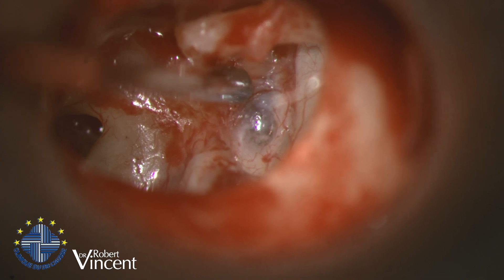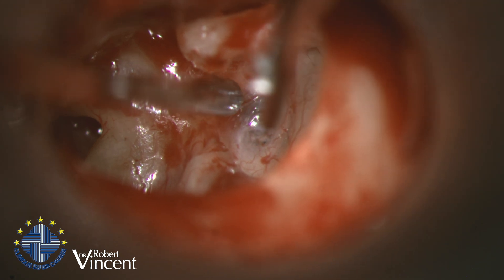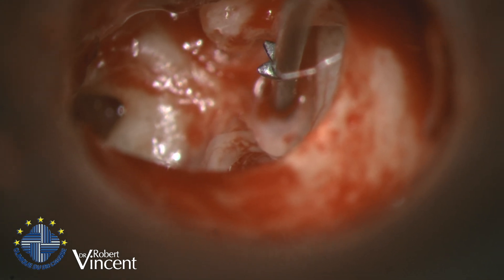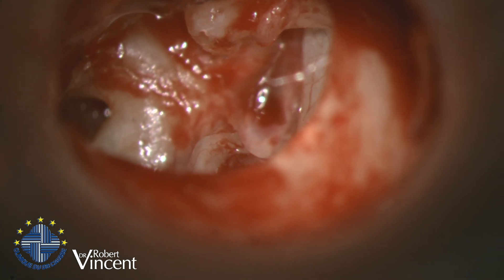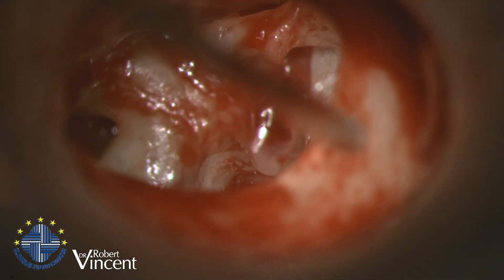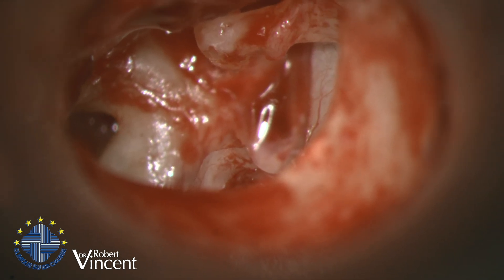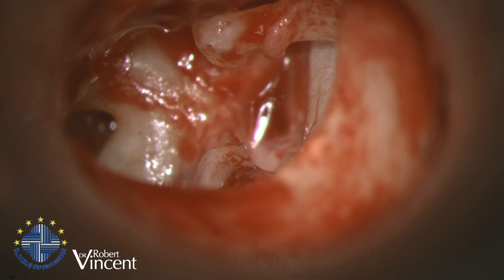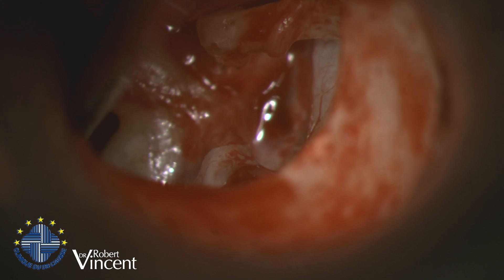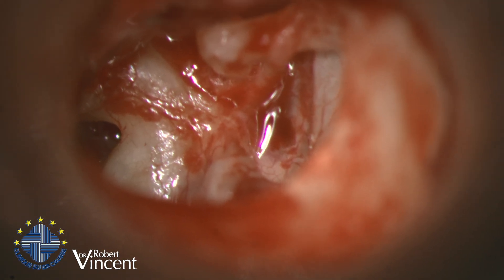Let's see the position — the circle is not exactly at the level of the stapedotomy, but very close. The 0.7 is safe. Measuring again, it's now four millimeters. So the length is fine — same as before, four millimeters — but the prosthesis had migrated. The length was correct but the position was the problem. I think this is due to the total stapedectomy, which is no longer used nowadays. Now I'm going to use the vein to cover it.